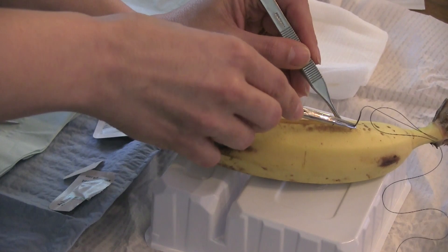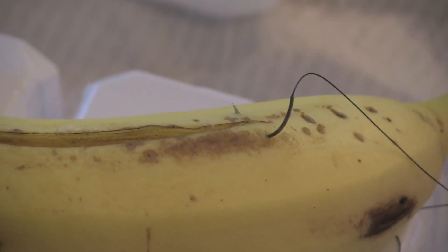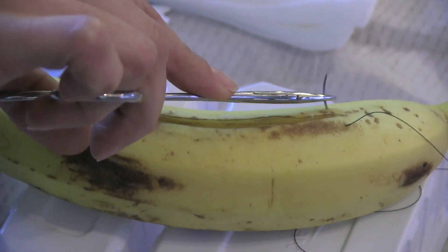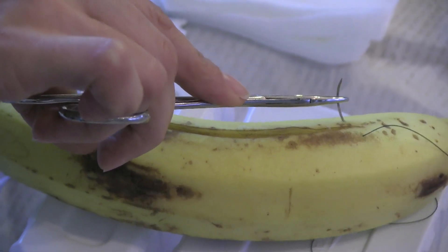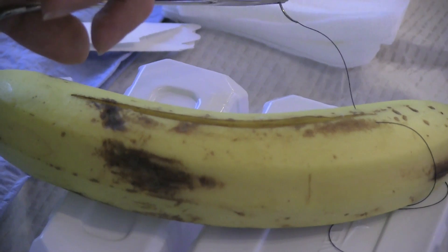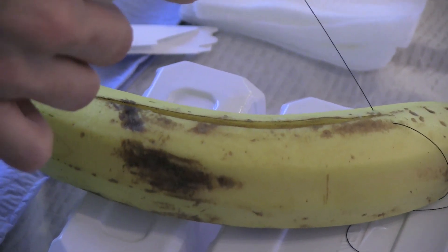Don't let the screams distract you at this point. Once the tip pops through, don't grab at it. Keep pushing the needle through from the other side, making sure to follow the curve or path of the needle as if it's one fluid motion. You don't want to yank on the skin or pull the material another way, because this will add more trauma — you want to cause the least amount possible.